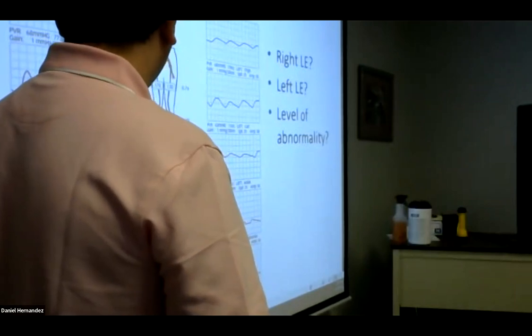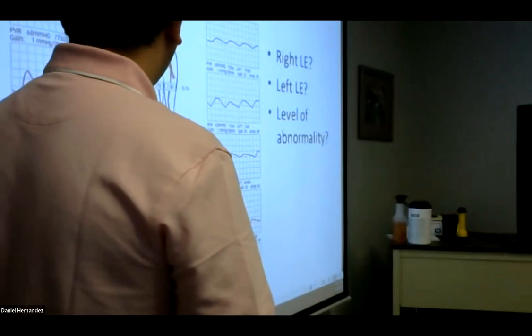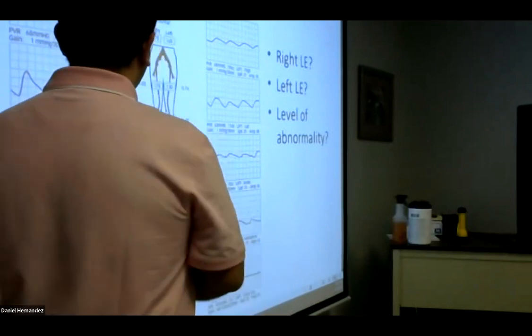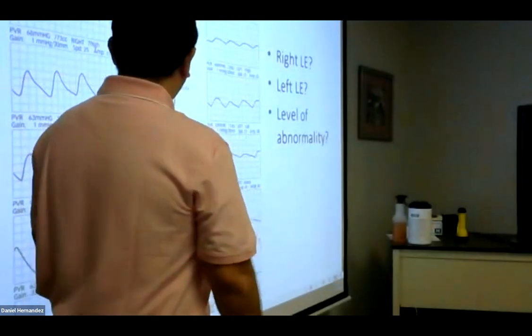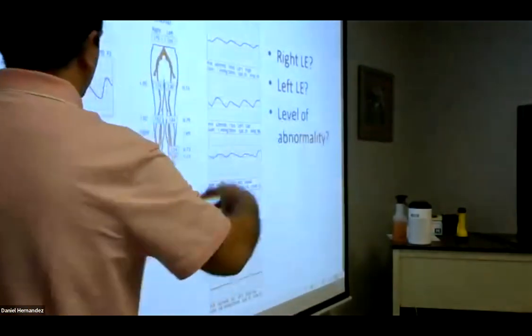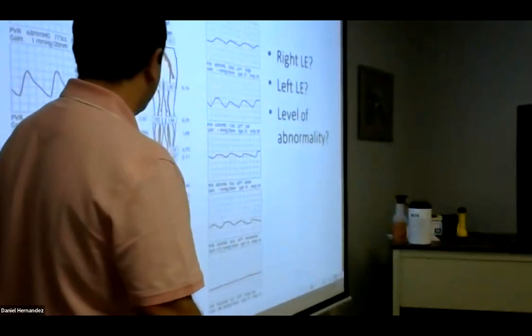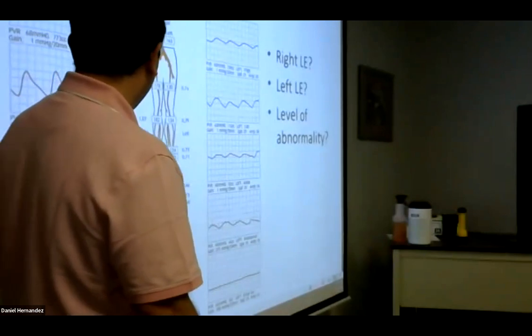What did you say was the normal range in which the pressures could be different? We look for 30, in between 30. So the first step is to go right to your ABIs, your ankle brachial index. Is the ABI normal or abnormal?